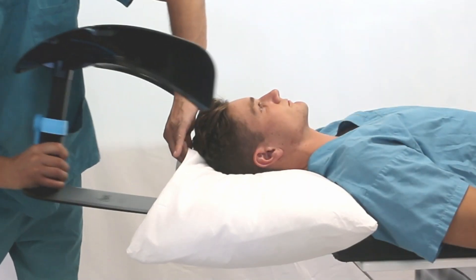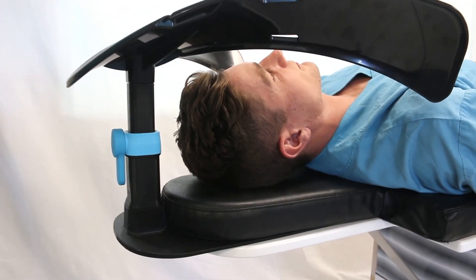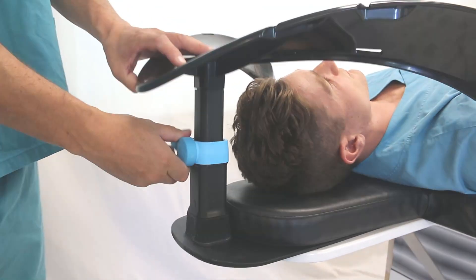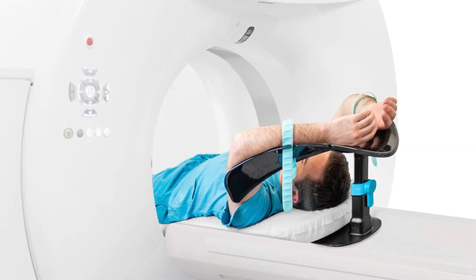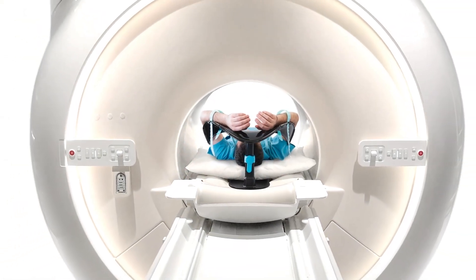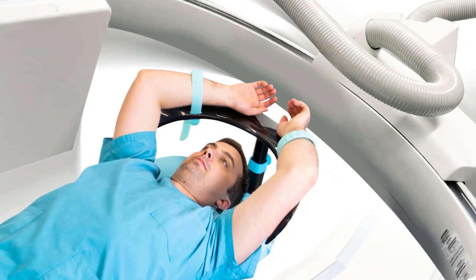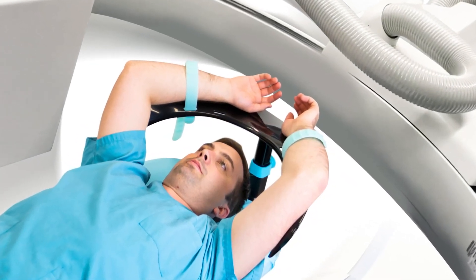Table placement is achieved by positioning the dagger board either beneath or above the mattress, where it is then supported by the patient's body weight. Designed for use with existing lab and imaging equipment, the overhead arm support fits within the bore of a 70 centimeter CT and MRI scanner and can be used with any c-arm imaging system.